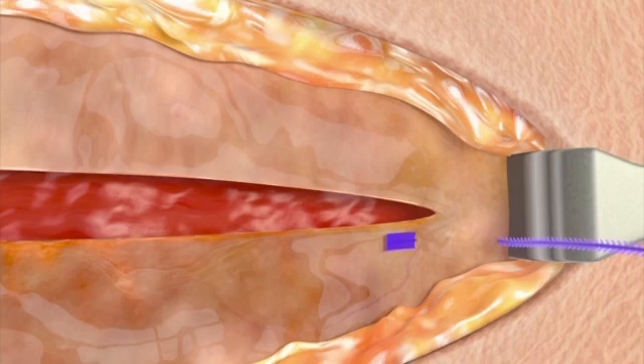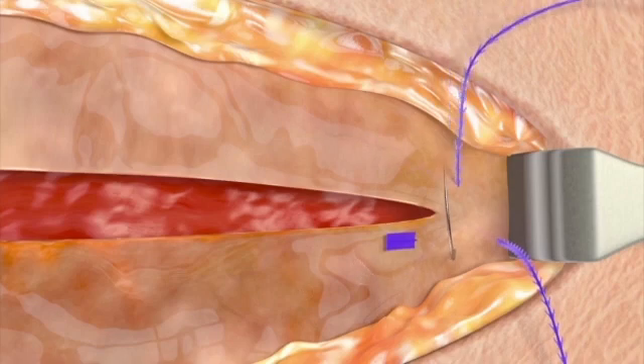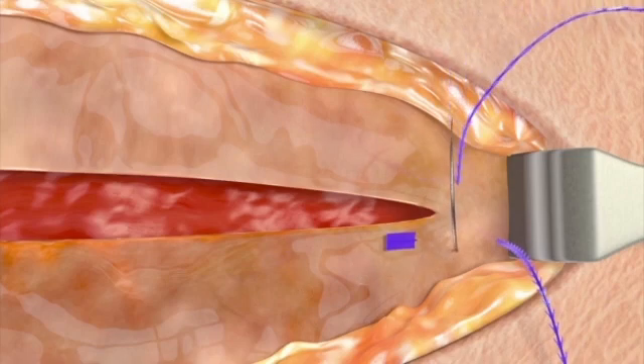Moving toward the apex of the incision, take a pass in intact tissue perpendicular to the initial pass to lock the stitch. Multiple passes are acceptable. Pull gently on the device to take up any slack.